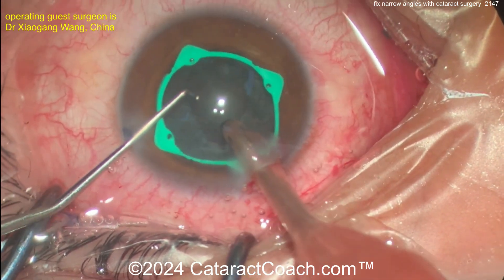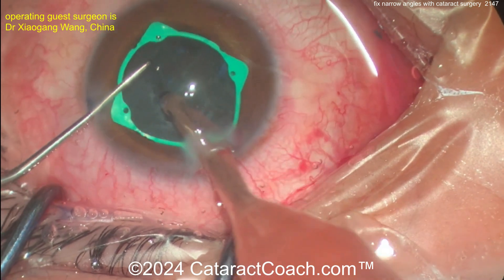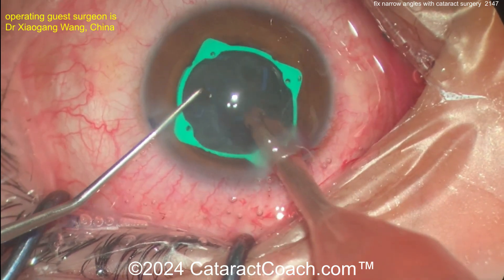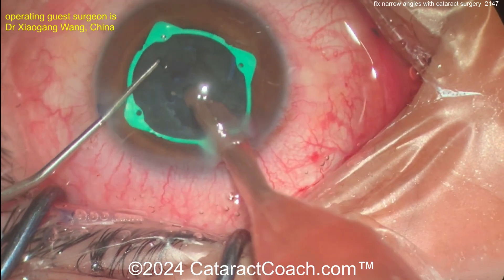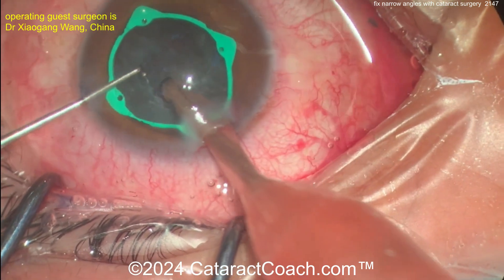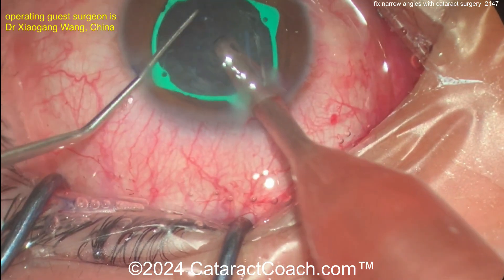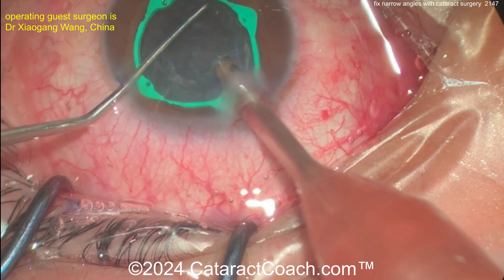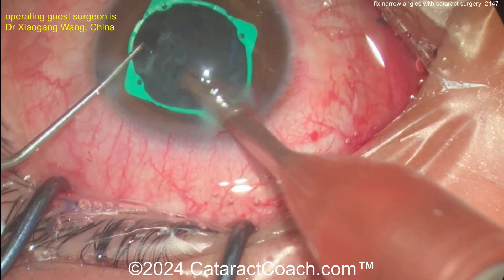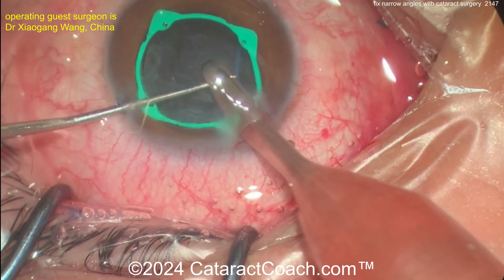We had a podcast with Johnny Gayden where he talked about how the best treatment for these narrow-angle, tiny eyes is actually pseudophakia — doing cataract surgery. So in a case like this, when you replace this very thick crystalline lens, this cataract, with a very thin IOL, by definition you open up the angles.